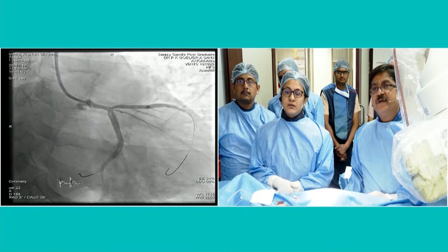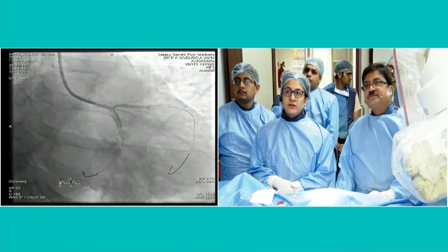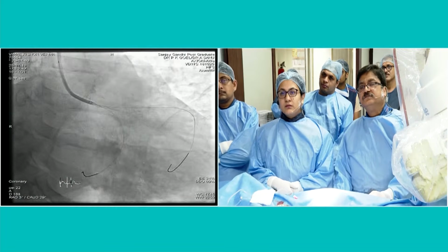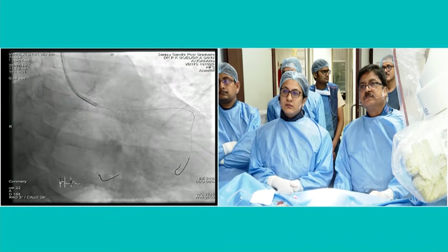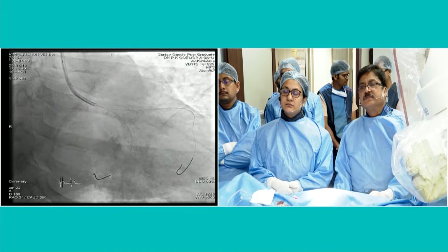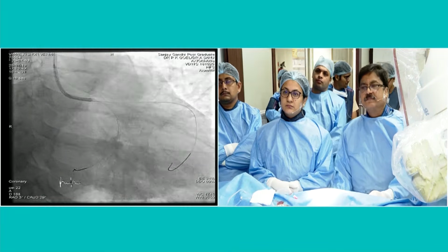Actually, I have a comment. What you did so far is pretty reasonable because I'm more than convinced that we should use IVUS for the left main evaluation, and particularly in this case, when you see this is a typical diffuse disease of the left main in which you don't see a tight stenosis, but actually you see a long disease involving the ostial LAD.